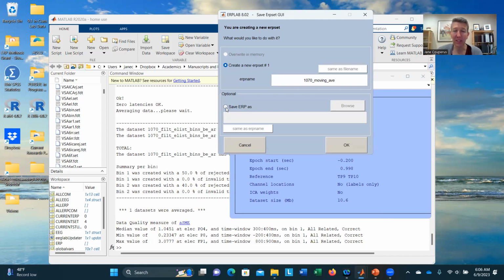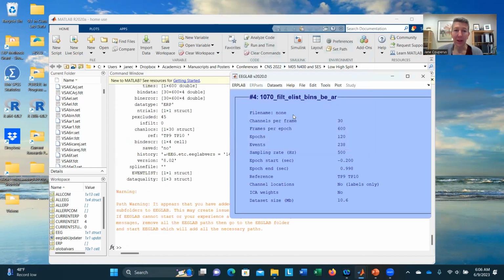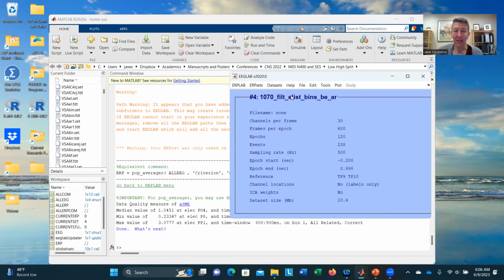You can also save this to your desktop or your computer somewhere by clicking this, browsing, going to the location, and saving it there. I'm not going to do that right now, but I am going to save it within the system. I'm going to click OK. And what's different about this is that now this is an averaged file. It's not going to appear in our data set list. It's going to appear in our ERP sets list because it's now not just a data set, it's an averaged file. So that's something to keep in mind: when you create these averages, you're now creating an ERP set, which is a little bit different.